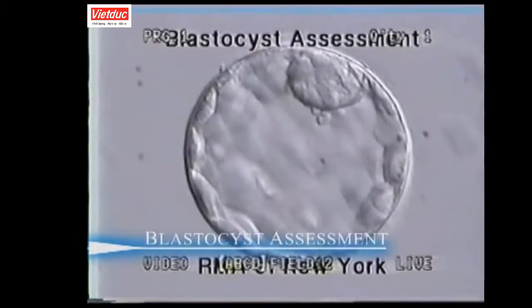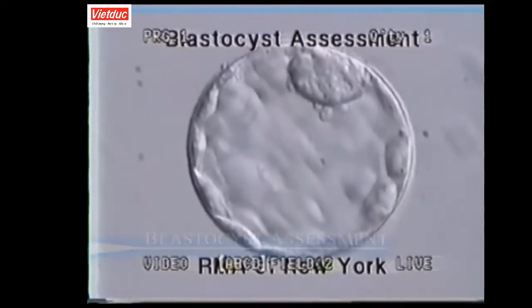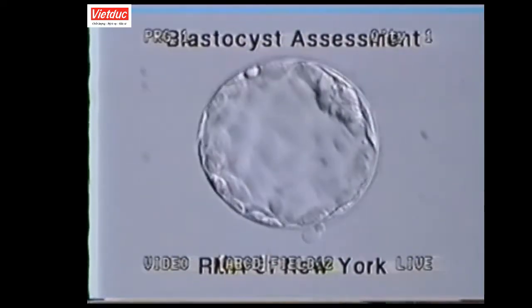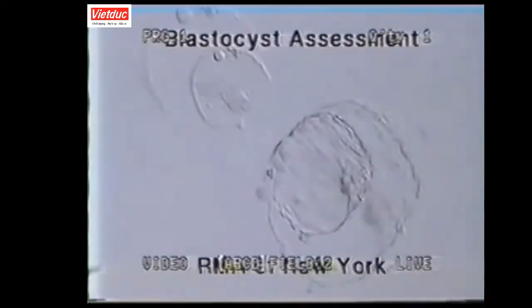If embryos are cultured past day 3, their development will be assessed on day 5 and day 6. The embryos, now called blastocysts, are assessed for potential transfer or freezing. They can range in quality as characterized by their size and the organization of cells that are beginning to differentiate around the fluid-filled blastocele cavity.